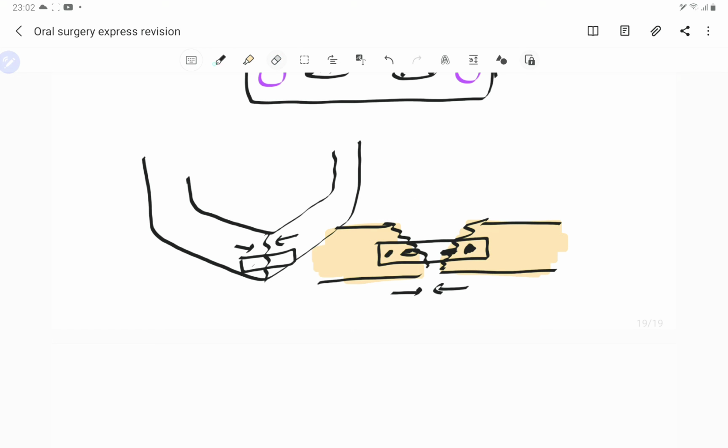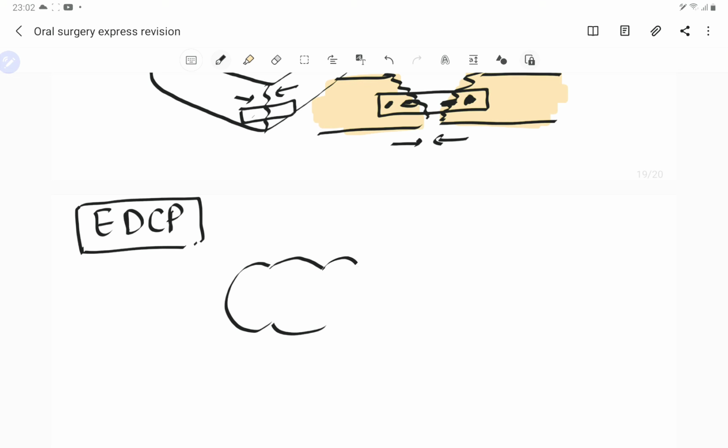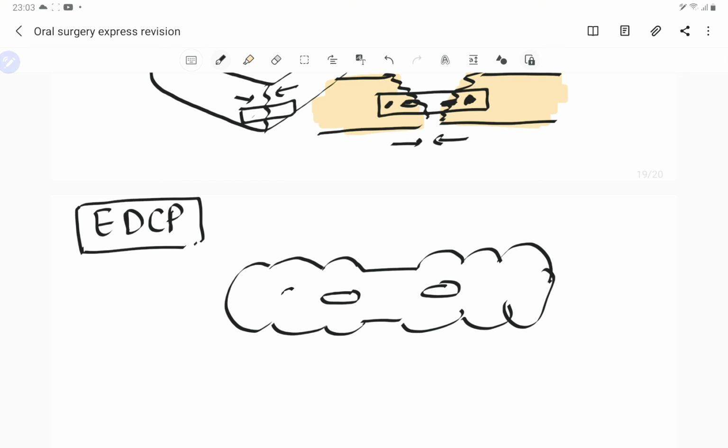So what we do is, we go for the eccentric dynamic compression plate. Now the added benefit of this eccentric dynamic plate is that it has two extra screws. So 1, 2 and 3, then we have this plate 1, 2 and 3. If you remember, the oval holes are the compression holes, then the round ones are the retentive holes, and there is one more hole extra, I mean two extra screws are placed, and these holes are oblique.